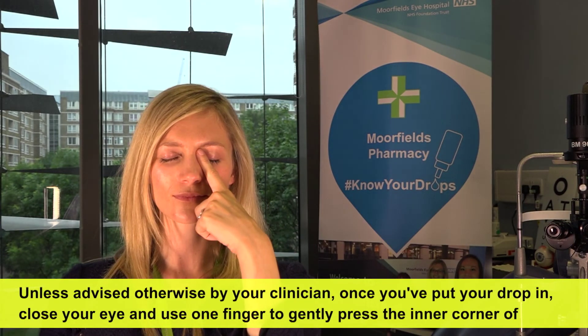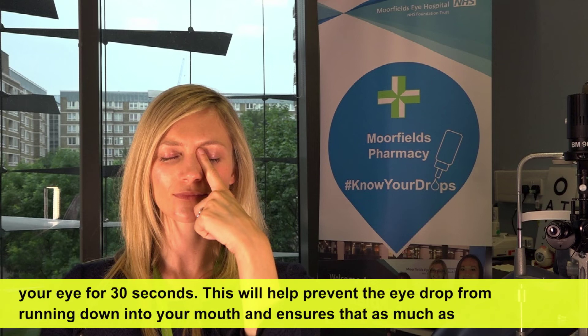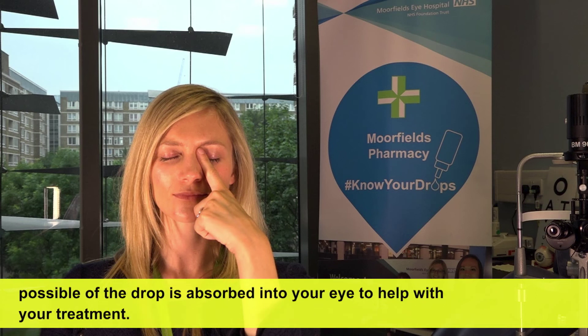Unless advised otherwise by your clinician, once you put your drop in, close your eye and use one finger to gently press the inner corner of your eye for 30 seconds. This will help prevent the eyedrop from running down into your mouth and ensures that as much of the drop as possible is absorbed into your eye to help with your treatment. Thank you very much.